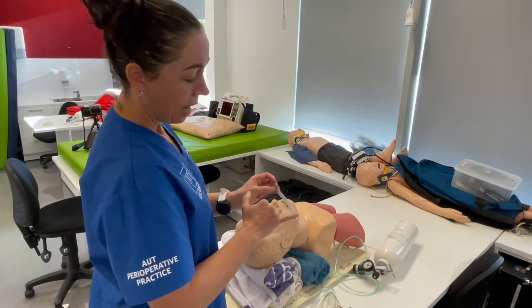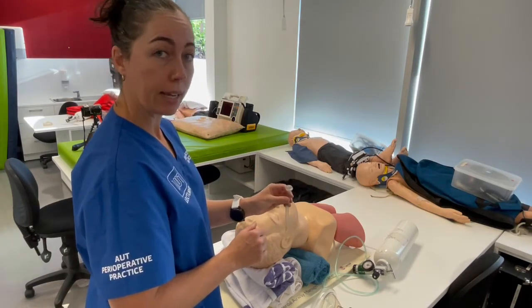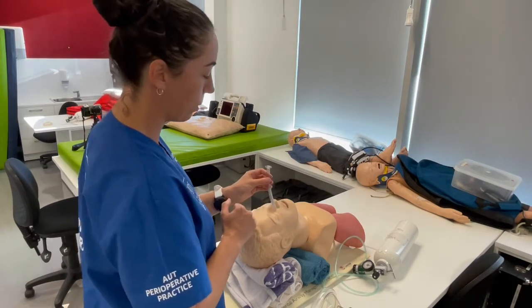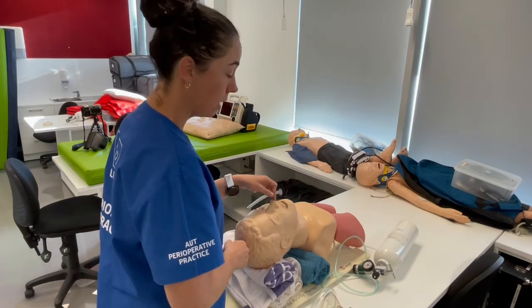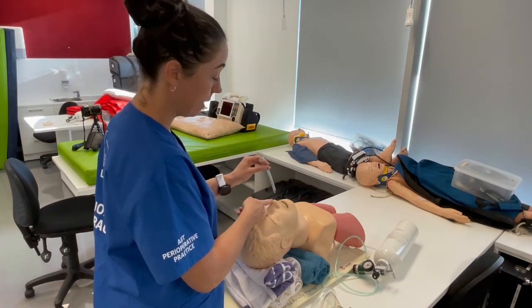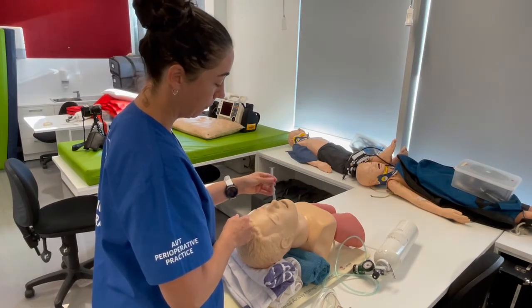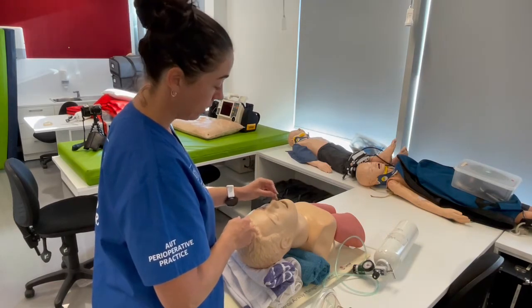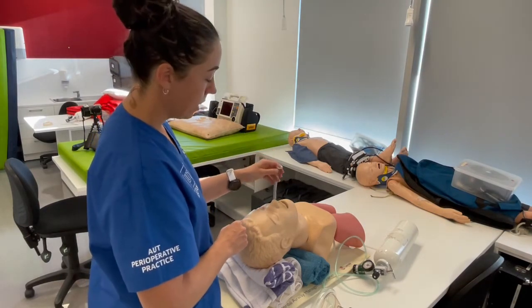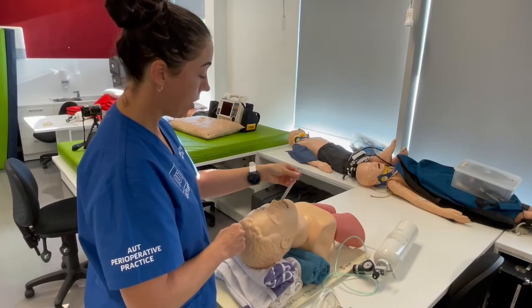The bevel is important for orientation of insertion. If your nasal airway comes with a safety pin in the packet, it must be placed through the airway before inserting it into the patient to prevent it becoming a foreign body. Identify the largest nostril, apply plenty of lubricant, and insert with the bevel facing the septum — regardless of which side you're inserting. Aim directly backwards, not along the line of the nose or you'll approach brain tissue. If you have difficulty, rotation can help spread the lubricant, or try the other nostril.